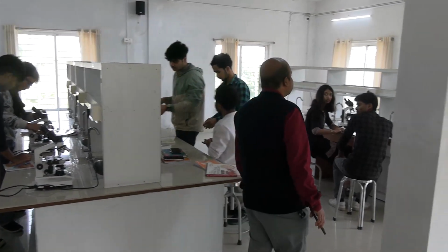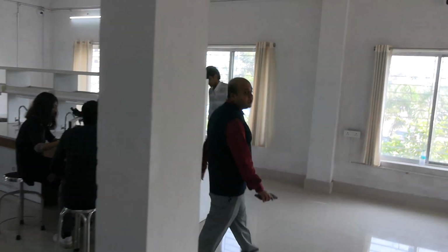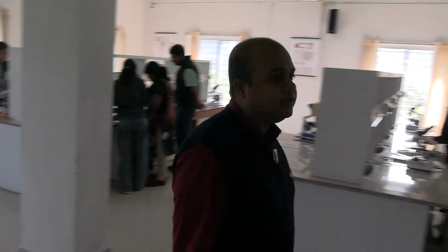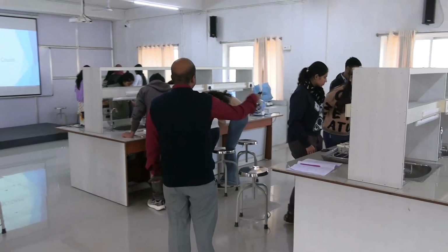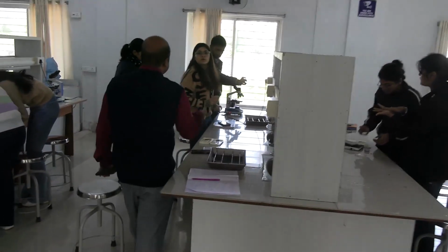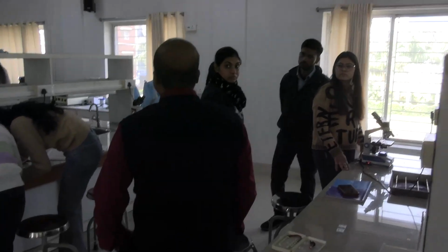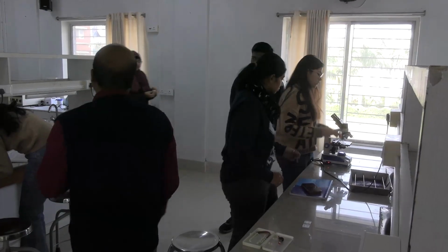Keep the microscope focus there, and then go for pipetting blood, taking blood, and charging it. Keep the focus ready so that you take out the Neubauer chamber, charge blood, and put it under the microscope again. When you focus after blood, you don't have to move the adjustment screws anymore, more or less.